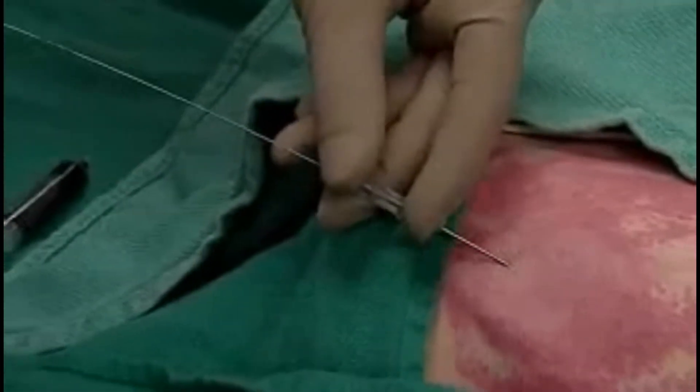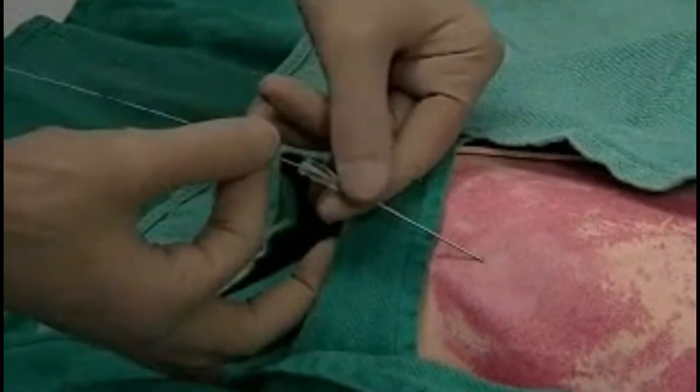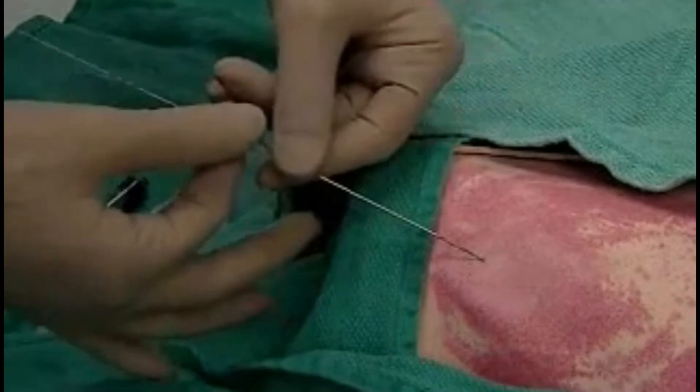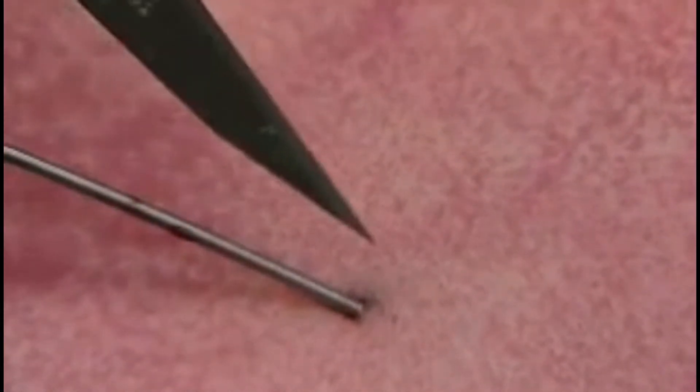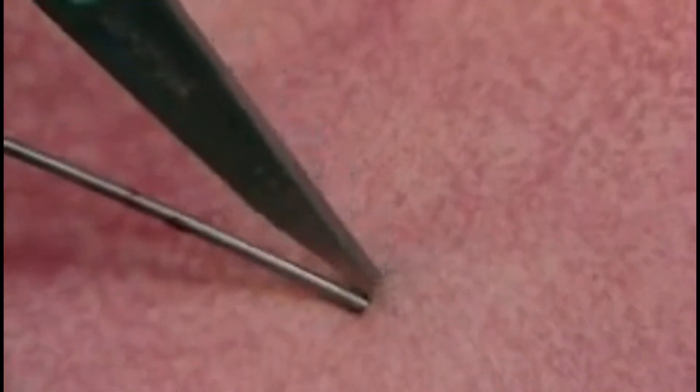Hold the wire as you carefully remove the needle. We'll take the 11 blade with a sharp edge up to make a small incision where the wire enters the skin. This will facilitate the passage of the catheter.